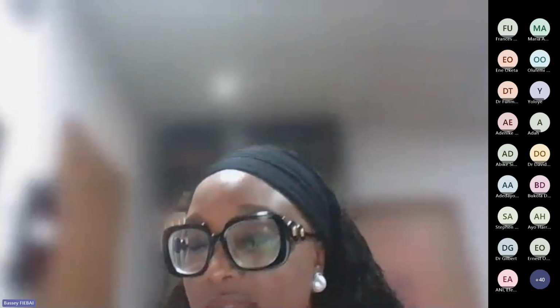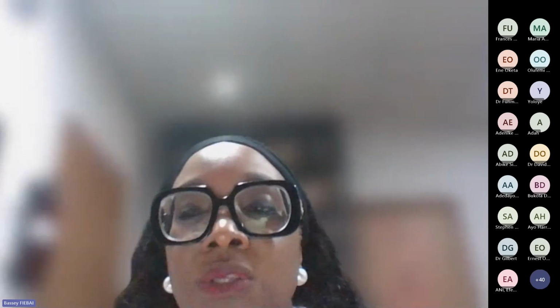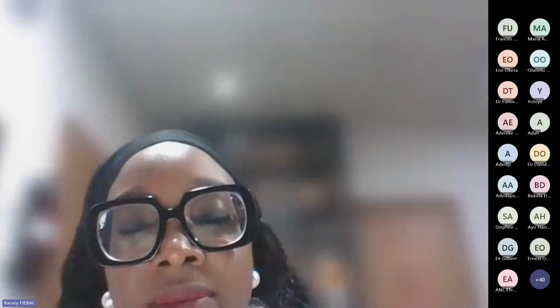So for the retinal detachments, what you'll be looking out for is that you will see 2 membranes. You want to know if they have the same characteristic or different characteristics. You want to know, am I dealing with one pathology or 2 different pathologies here?